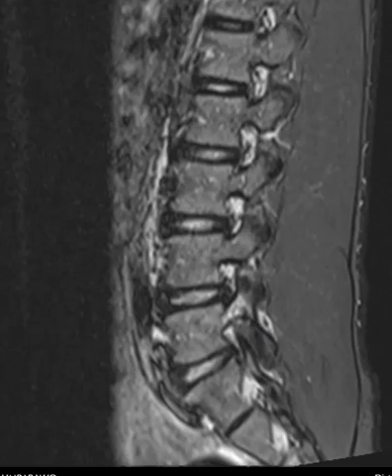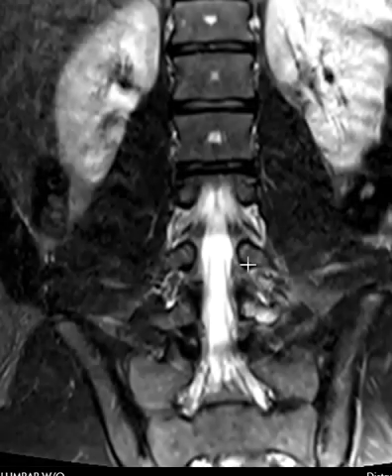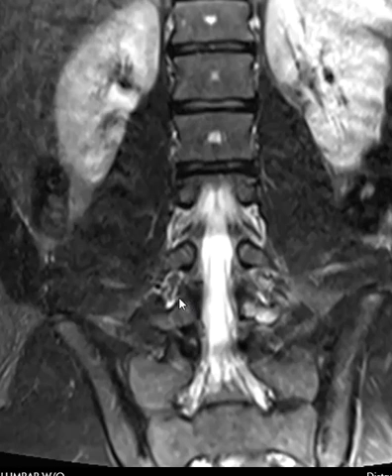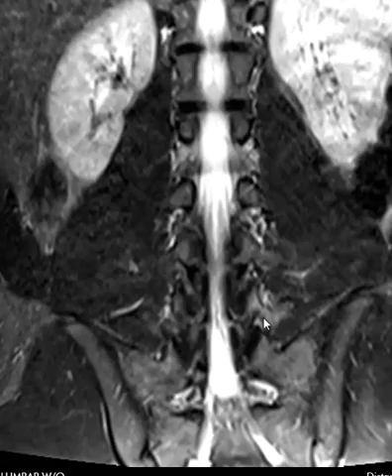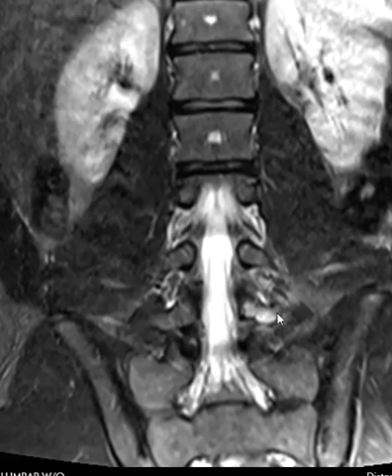We have one other sequence that shows this maybe better than anything, and this is called a STIR sequence. With marrow changes, anything in the bone that's abnormal shows up as bright. So if we look here at the right and left pedicle — looking normal — then we go to this level: right looks good, but the left — see how bright that is? So this is that left L5 stress fracture. And that's it. Thank you so much.